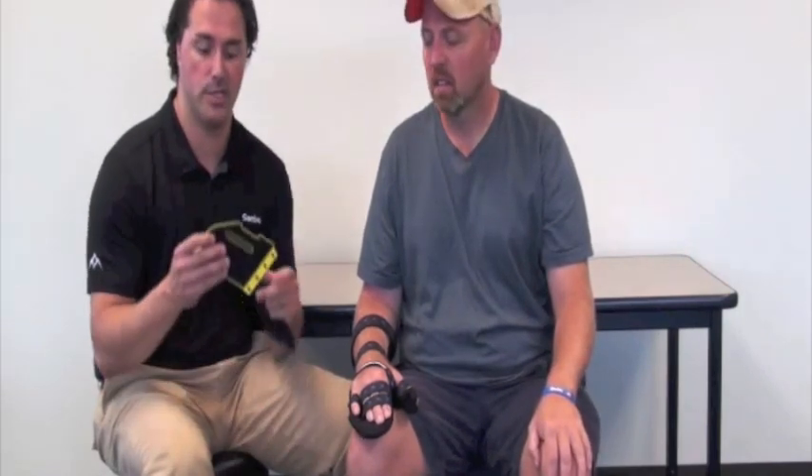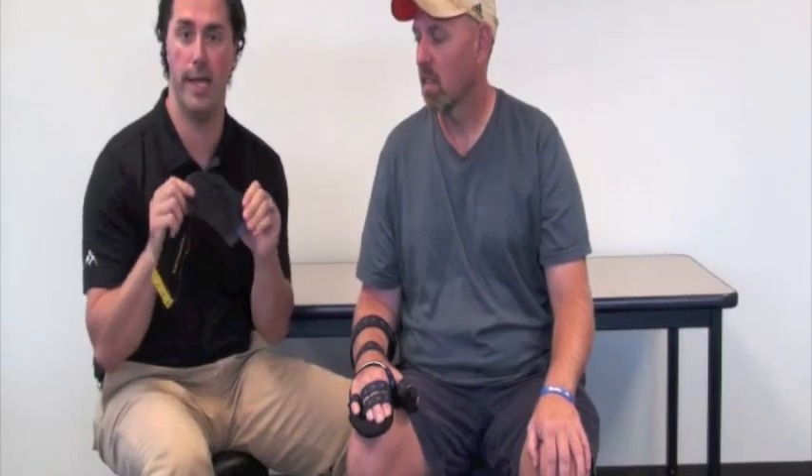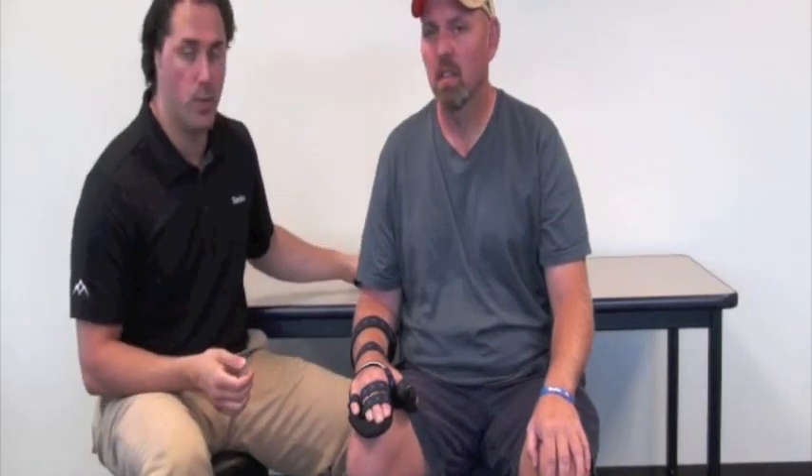We selected the red hand plate, which came with the Sabo Stretch, as the primary hand plate for Tony. We can certainly change to a yellow or weaker hand plate depending on his tone, or a blue hand plate. We're going to have Tony try something exertive such as walking — if the fingers pull out of the splint, that tells us we can do two things.